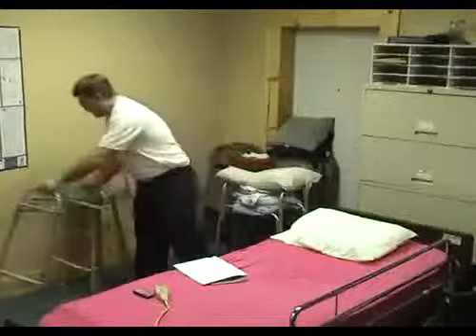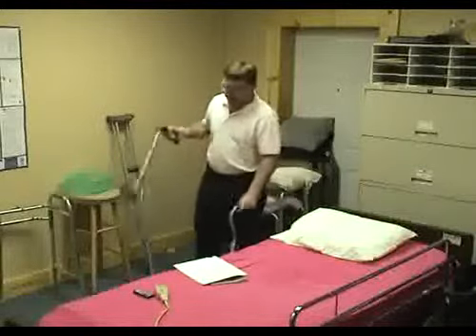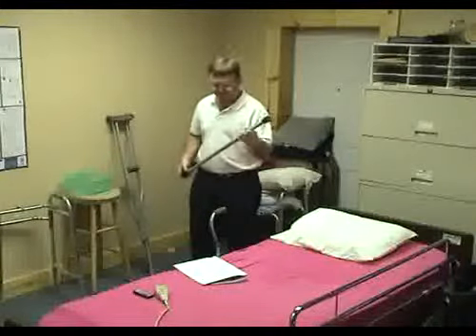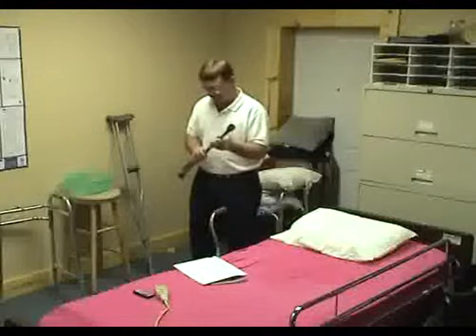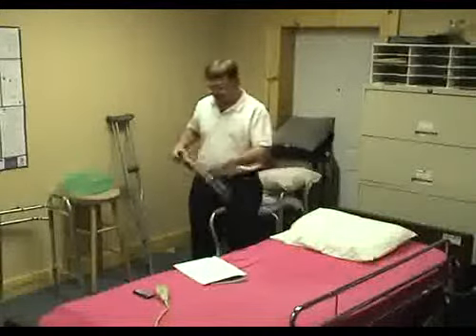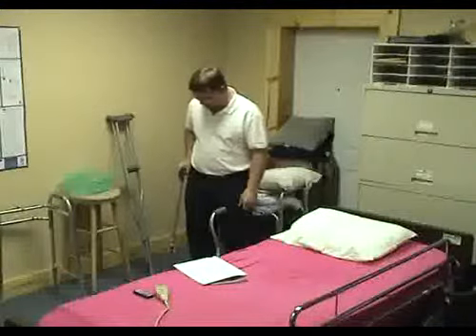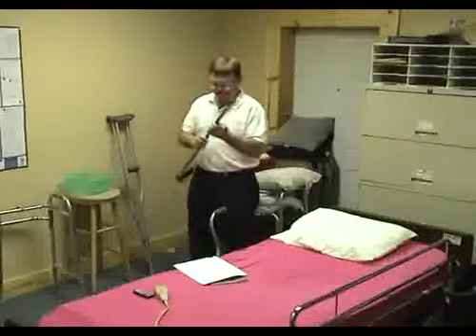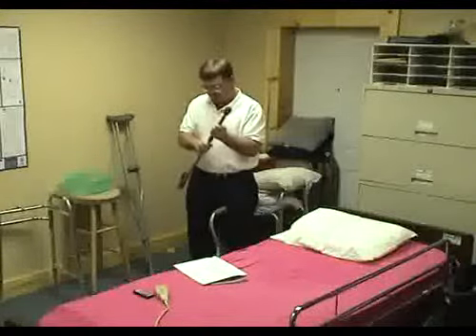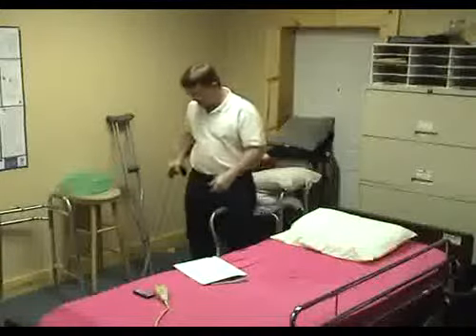Now we've got two different types of canes here. This is a straight cane, which is also adjustable to different lengths, just by simply pushing the button. This is too low for me. It should be right about the hip, depending upon how tall your patient is. That's better.